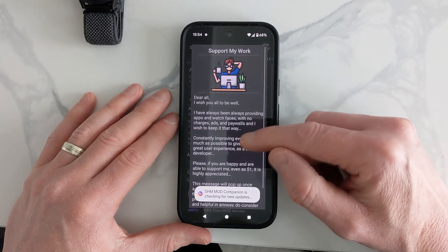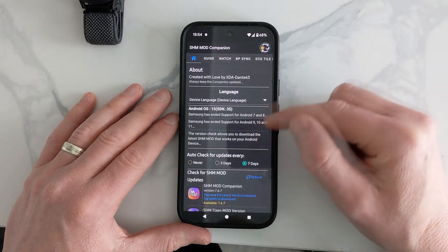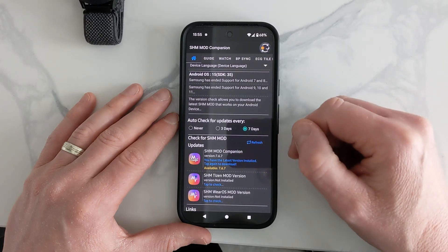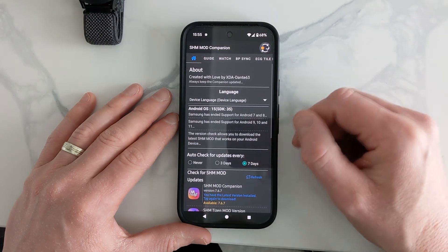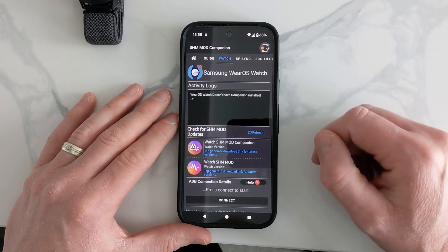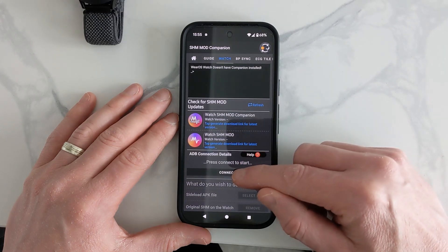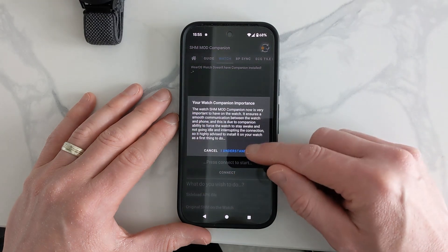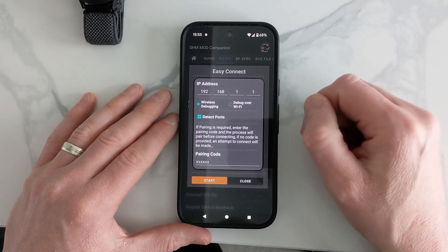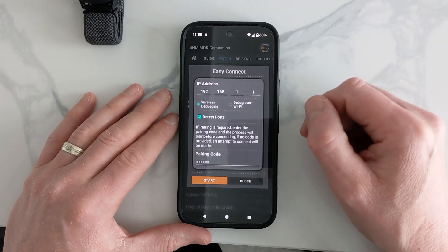Once it's done, open the app and dismiss the initial prompt. It'll tell you the current update — at present it's version 767 and we're on that. Go to Watch, press OK, and now we're going to connect the phone to the watch. It needs the IP address of the watch and the pairing code.